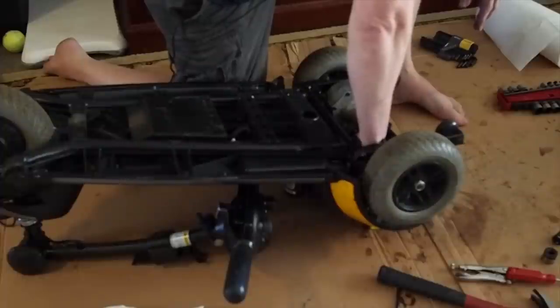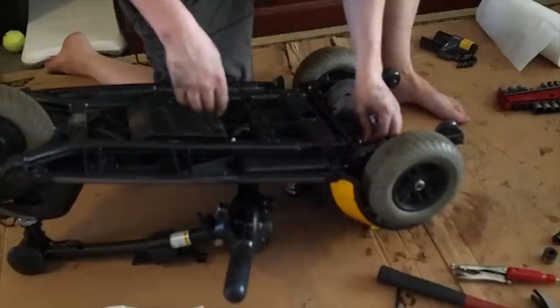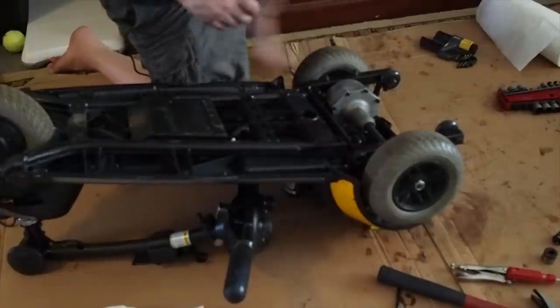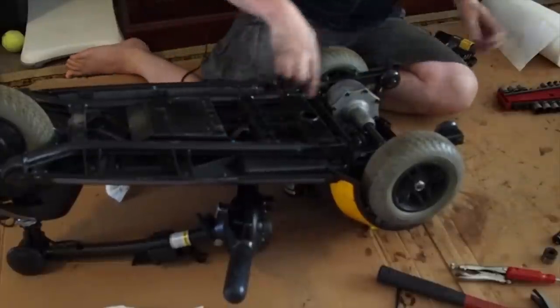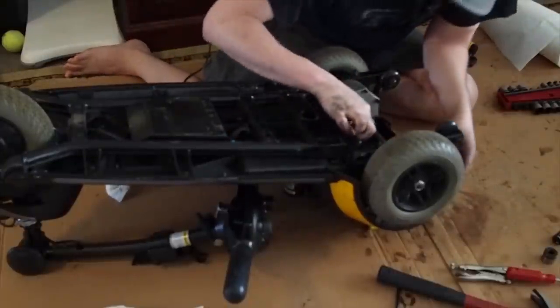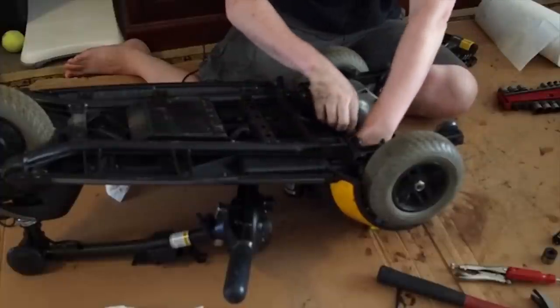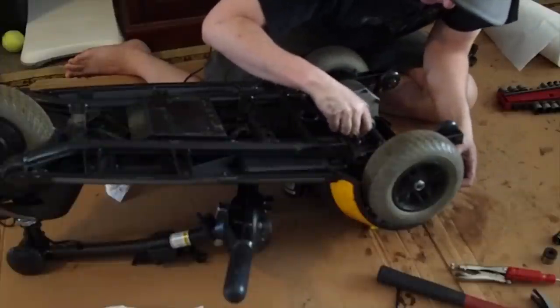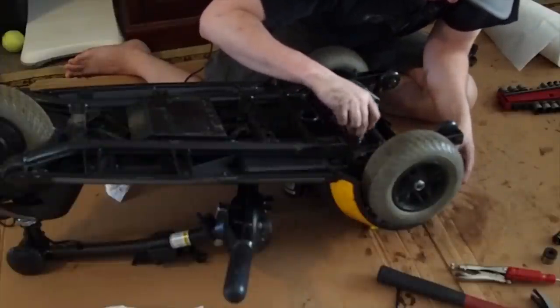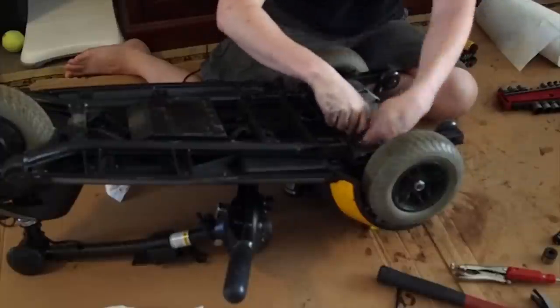But generally speaking, the screws on this don't seem to fall out. The only ones that have fallen out are the screws that go on the arms, and it's just because they are acting as pivot joints, and those arms are going up and down all the time. Every time Sherry gets out of her chair, she lifts up one of the arms.